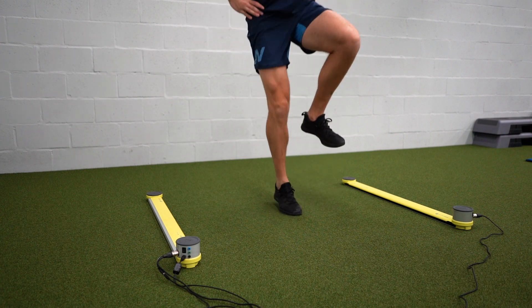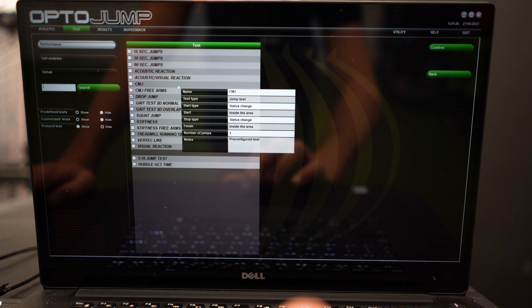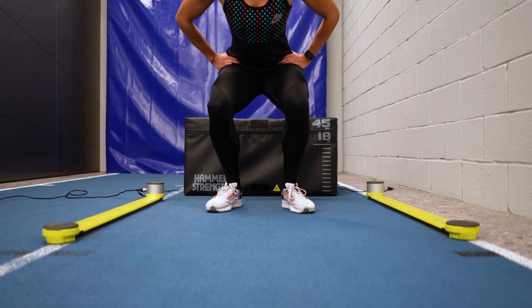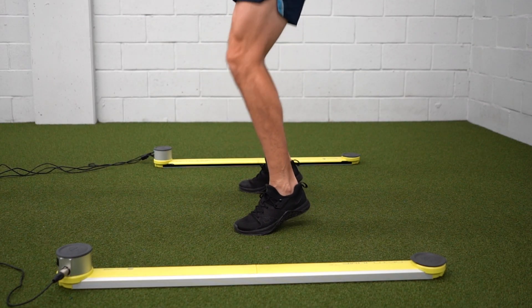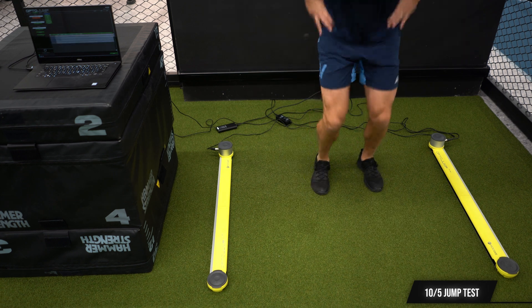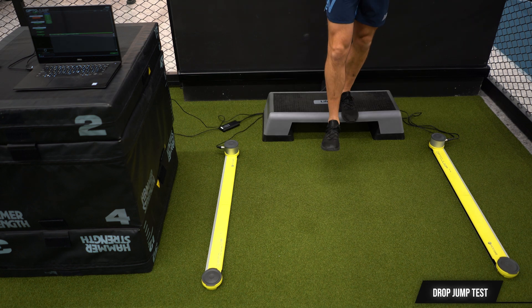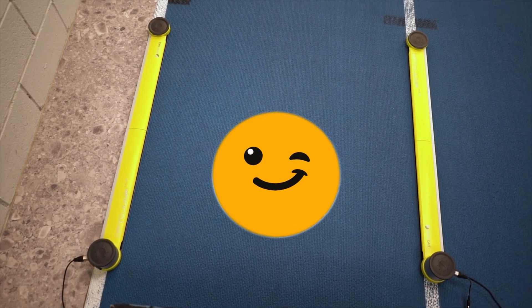While the rehab and prehab tests are a nice bonus, the main focus for us on this channel is of course on the performance side — and this is where the OptoJump really shines. The most obvious application is for jump testing, from testing the athlete's explosiveness through squat jumps, to stiffness tests like the 10-5 jump test or drop jump test to determine an athlete's reactiveness on the ground — all a piece of cake for the OptoJump.